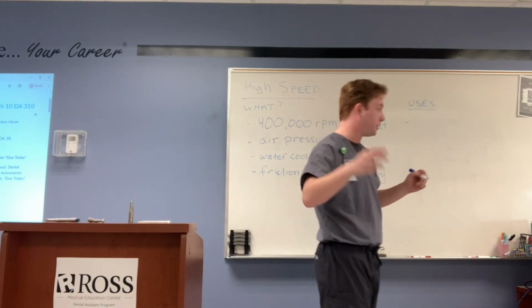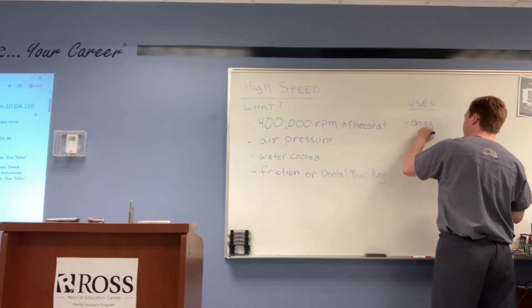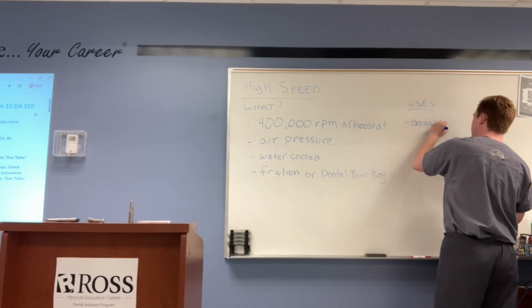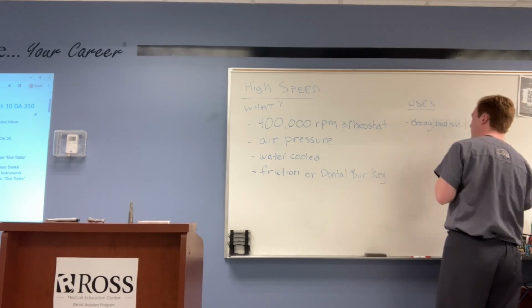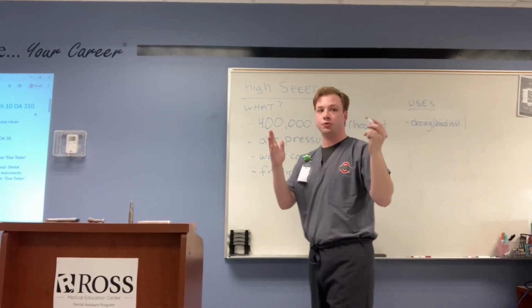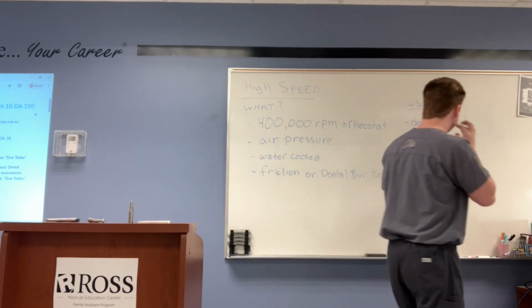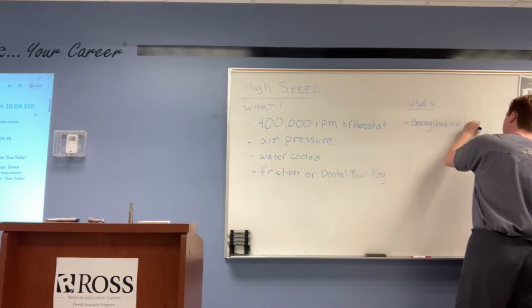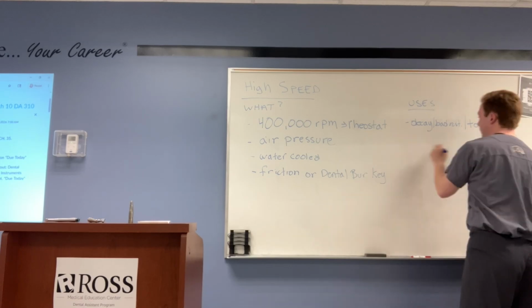I'm going to mix those all together. Tooth decay, a bad restoration, or tooth structure, healthy tooth structure.